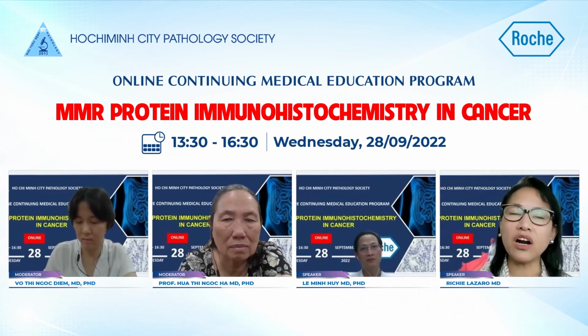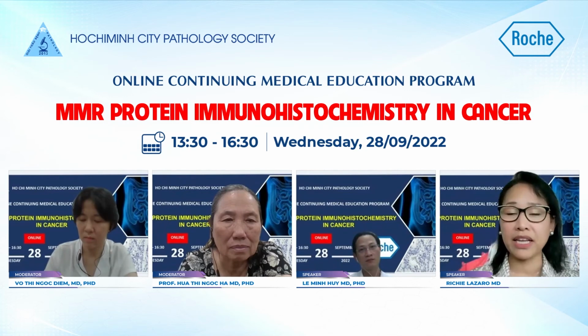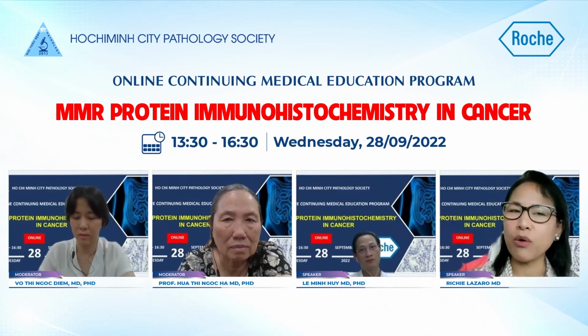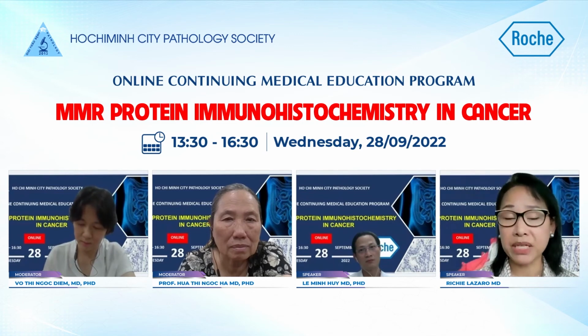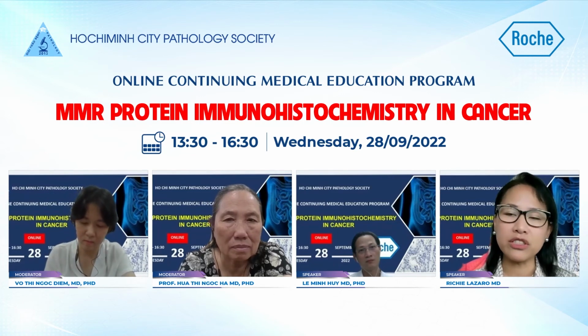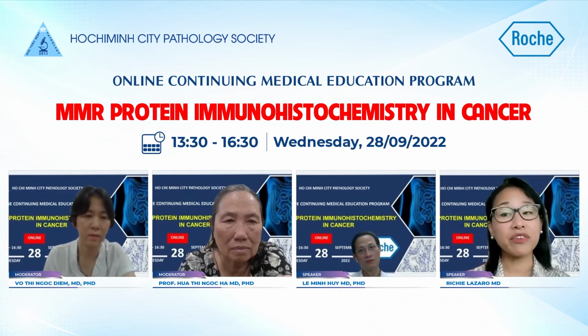So there are some who might economize and cut cost by using only 2 antibodies like MLH1 and MSH2 only, for example. But then what if only MSH6 is lost, or what if only PMS2 is lost? That will be missed if only 2 markers are to be utilized. So by default, for all solid tumors, the recommendation is to use all 4 antibodies, preferably.